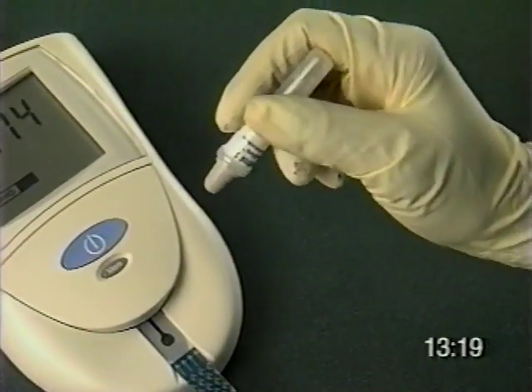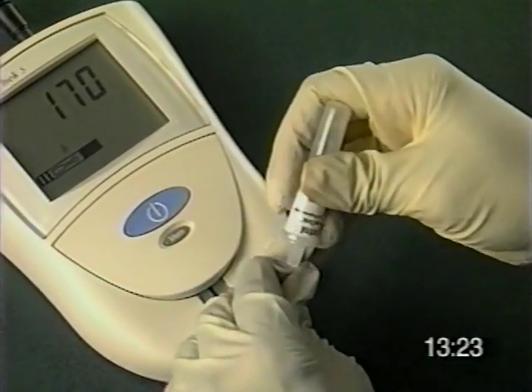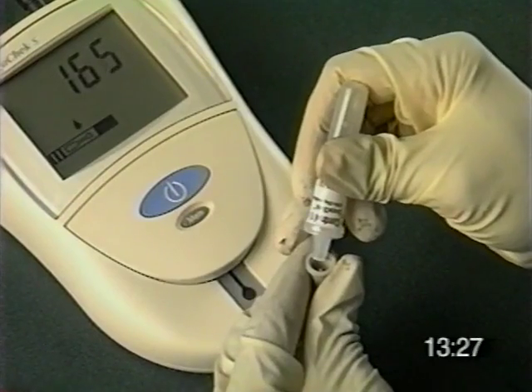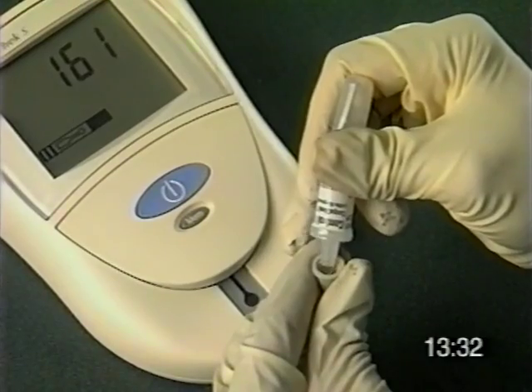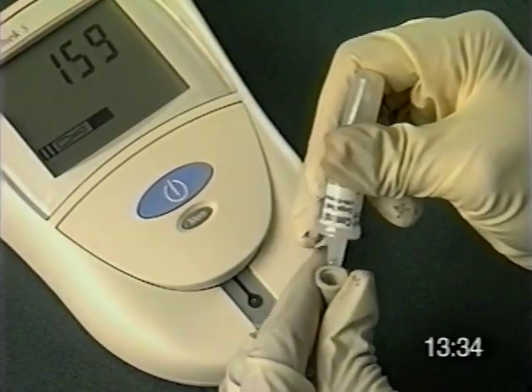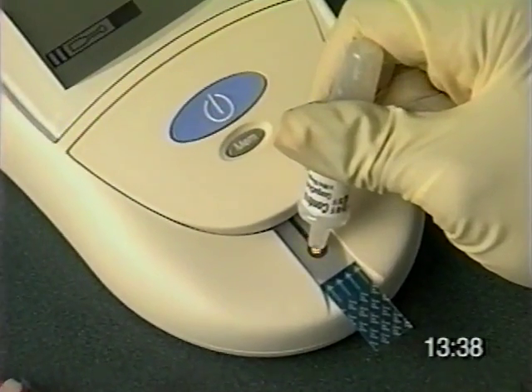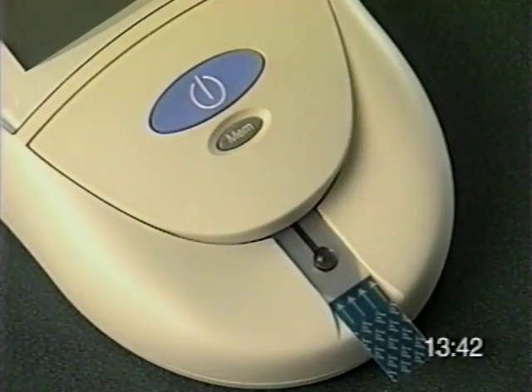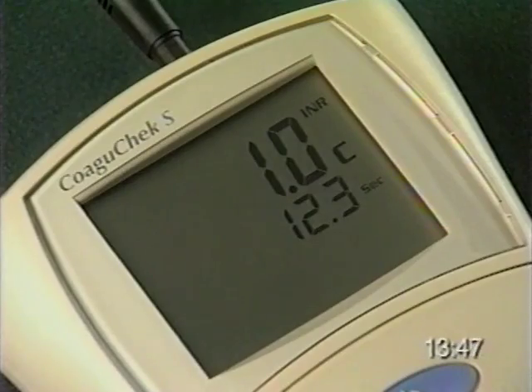I shake the contents of the vial down to the dropper end, and with the dropper end down, I remove the cap. The first drop should be discarded into the cap. Make sure the second drop is clear and free of bubbles. Then I hold the vial directly over the target area and apply a drop to the strip. The monitor beeps when it detects the drop applied to the strip, and when complete, the test result will be displayed.